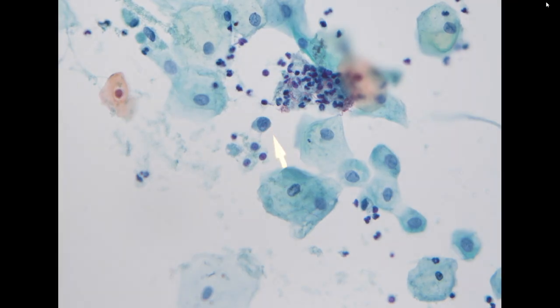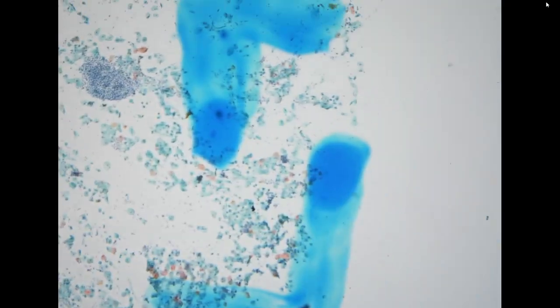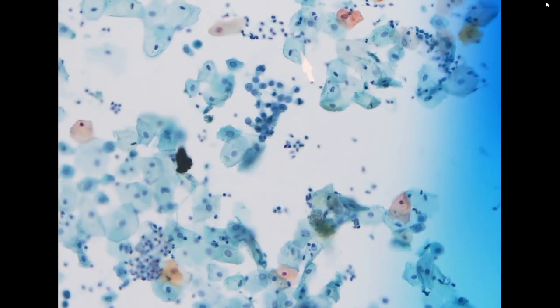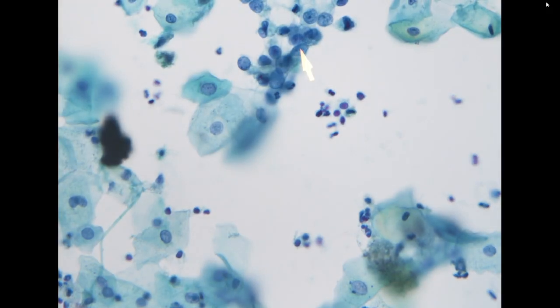So these cells look atypical. But the nucleus is not markedly enlarged. Basically, the size is similar compared to the adjacent cells. Here we also see some cells with increased NC ratio. And I think that's it.